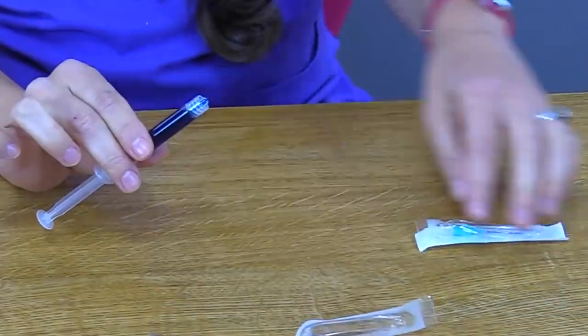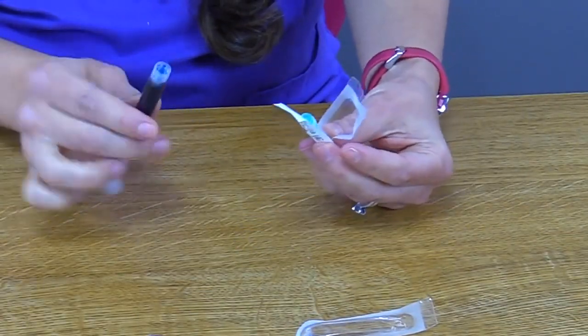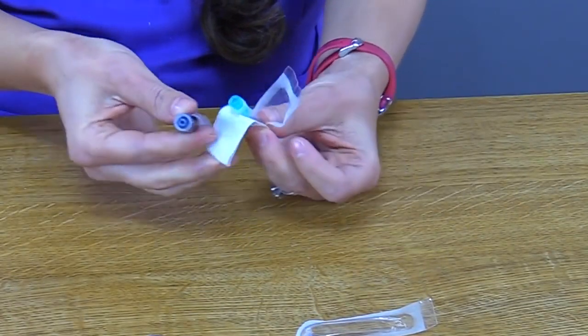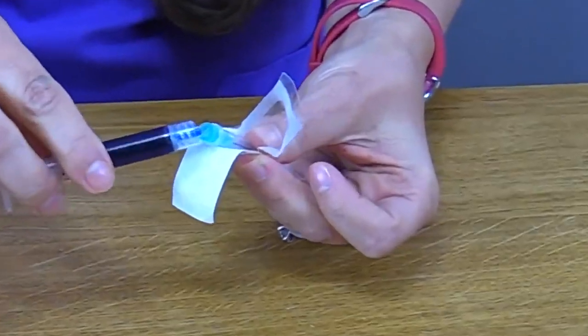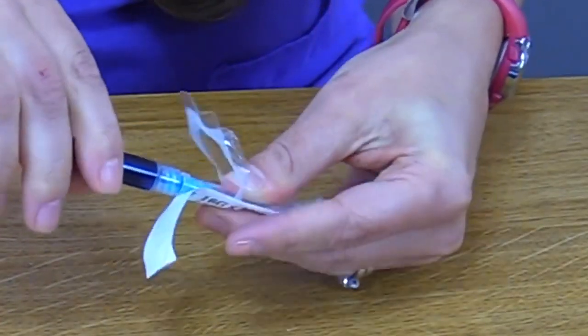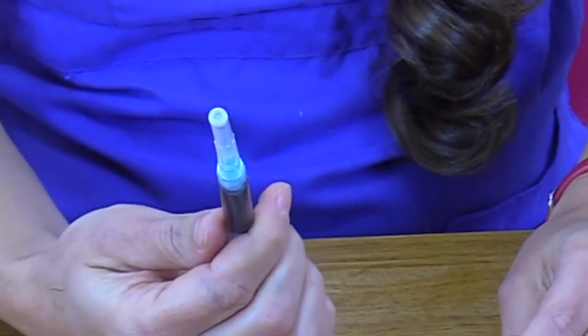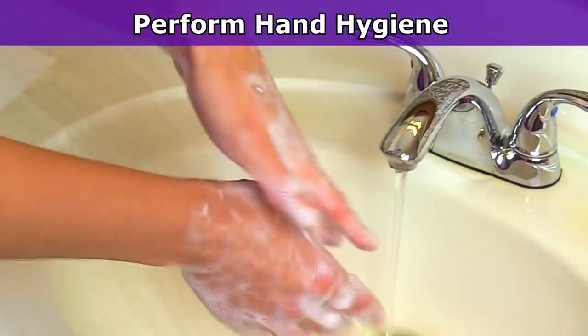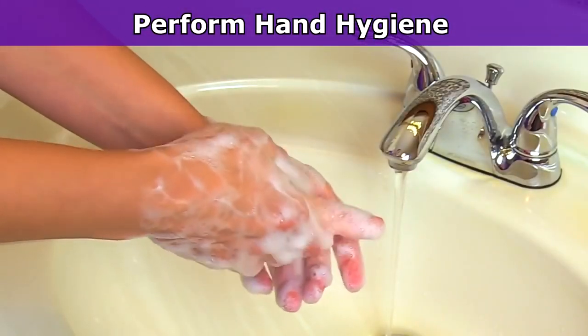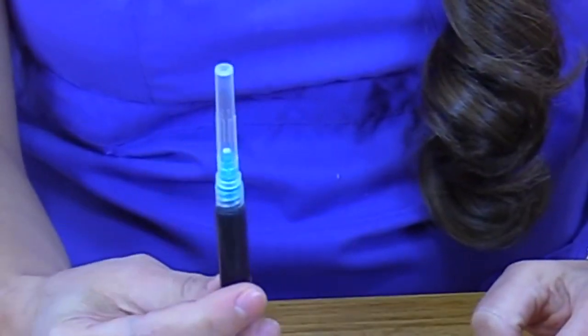I'm going to connect my new needle, so it's in the packaging, and I'm simply just going to connect it. And again, the important thing you need to do, I'm going to twist it on securely. And it has its cap on, and it's ready to give to our patient. So I'm going to perform hand hygiene, double check everything again, and then I'm going to administer the medication.